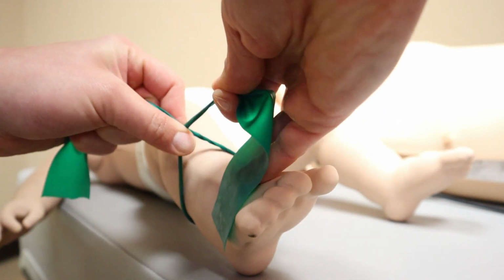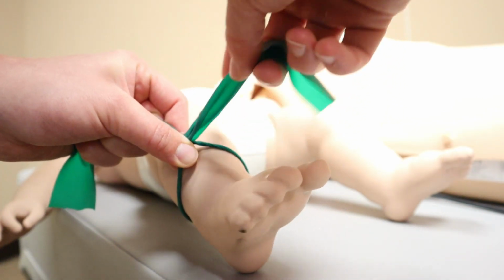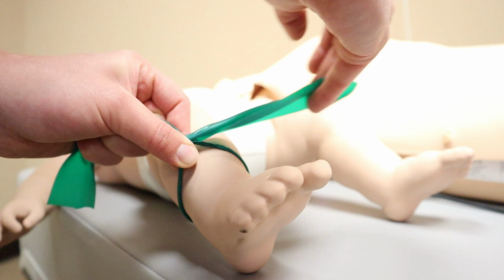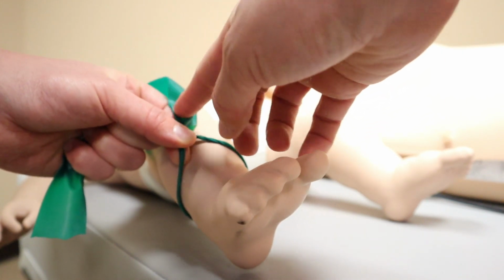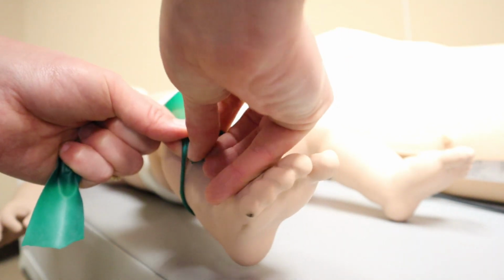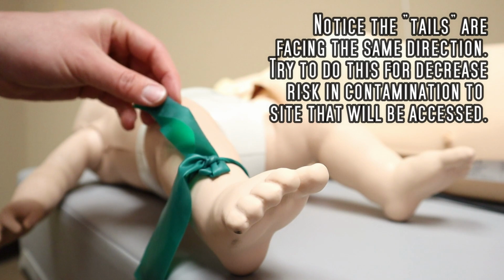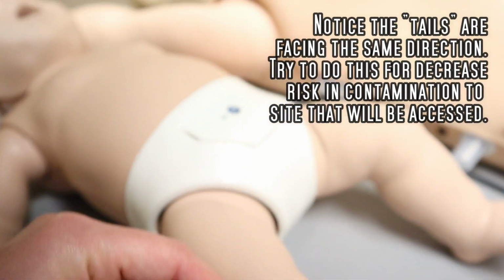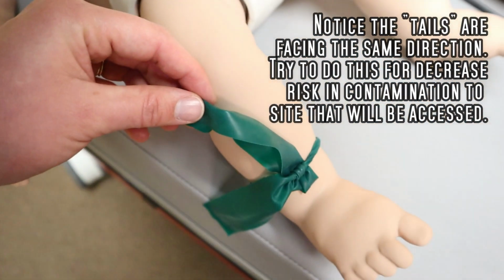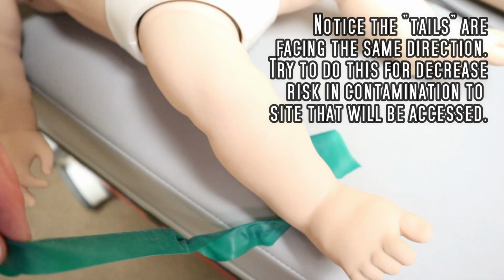I'm right-handed, so I'm using my right hand to hold that. I'm sorry, I'm using my left hand to hold here. This is the pigtail on my right hand, and I am taking this and just tucking it under, and that is it. Now here is that pigtail that I created again, and all I have to do when I'm ready to take this off is simply pull that, and it comes right off.